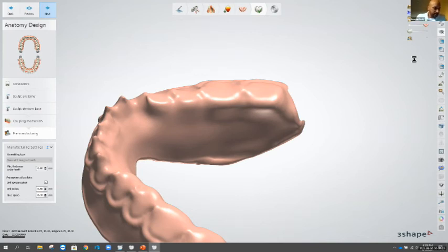in the patient's mouth. The advantage to it though is that I have seen some clinics that print it in a material that's a little stronger, and they will allow the patient to leave the office wearing it for, you know, the 2 weeks or however long it takes for them to manufacture the final. And then what they'll do is they'll come back and let the doctor know, did they like the shape, size, maybe shade or fit, see if there was any issues with it. And if there weren't, then they'll give them their final dentures and then they're ready to go.